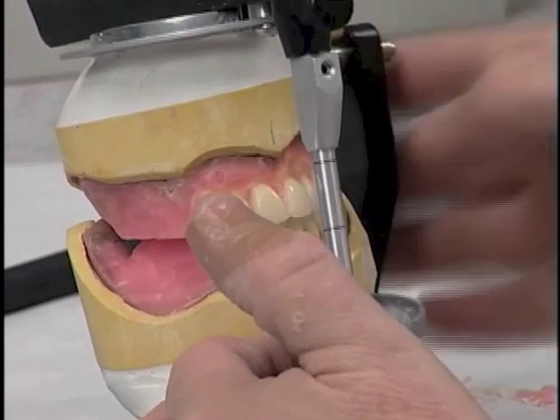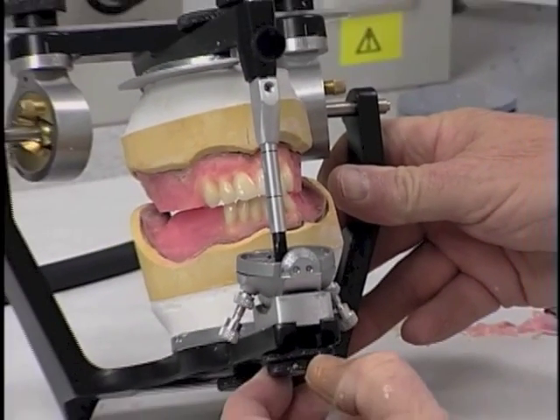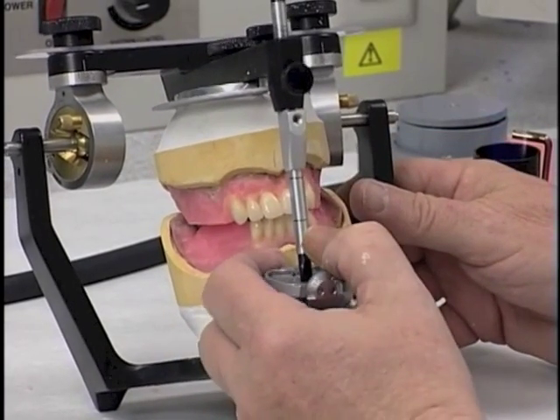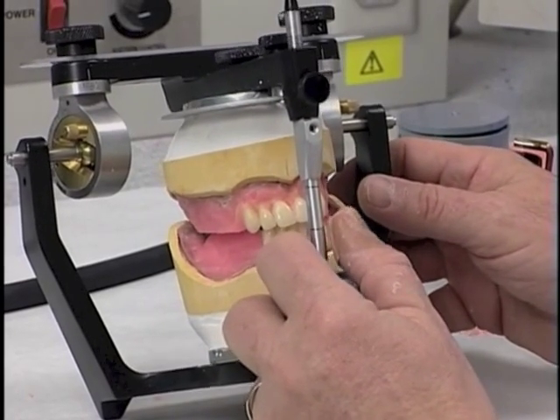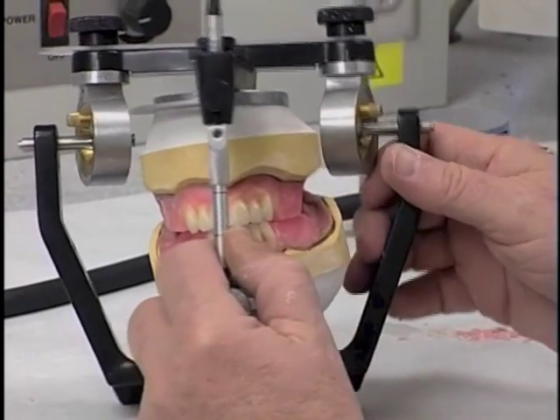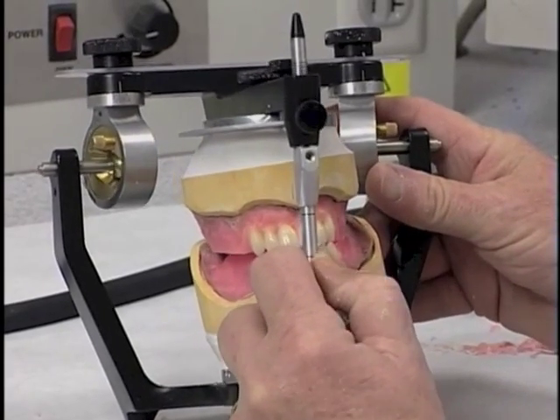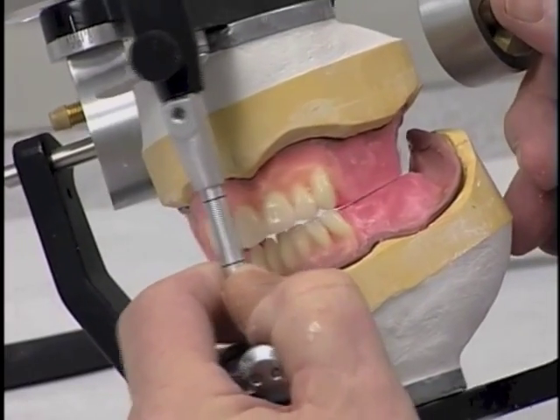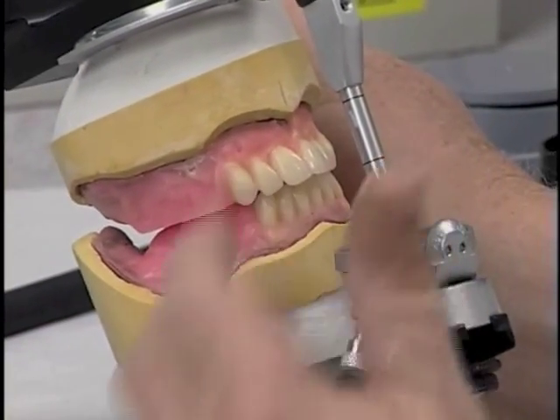So we can lock that in place now, and that's going to protect, from a straight protrusive standpoint, the anterior teeth so that we don't have a bump in the occlusion as the patient goes into protrusive or into right or left lateral. Now let's try the lateral motions, and we'll see that basically we're not in bad shape there. The teeth are just glazing without a bump, and that's with very little incisal guidance to the lateral.